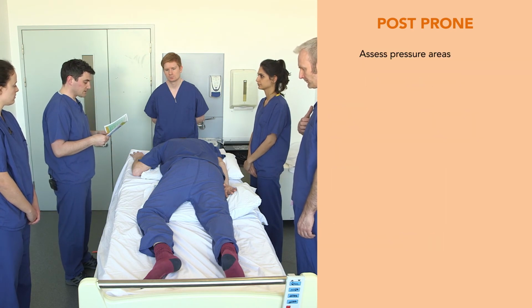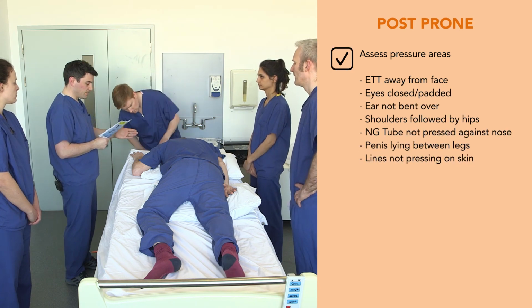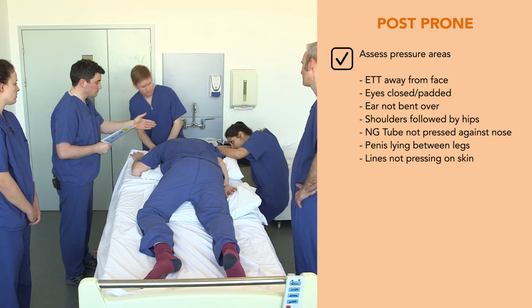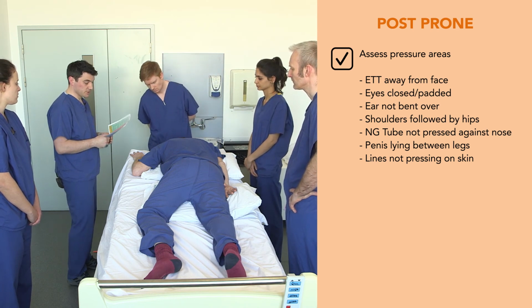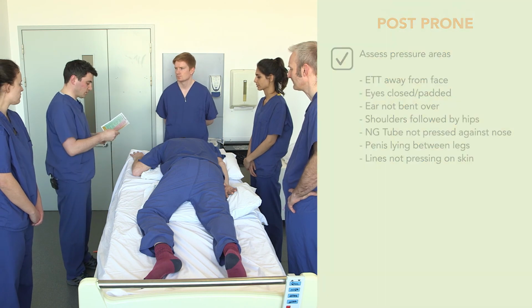We now need to assess pressure areas to ensure that the ET tube is away from the face, the eyes are closed and padded, the ear is not bent over underneath, the NG tube is not pressed against the nose, and the patient's penis is lying between his legs. We need to finally ensure that there's no lines pressing on the skin.